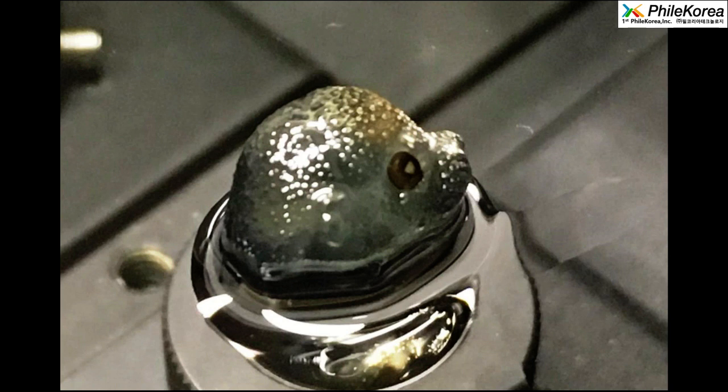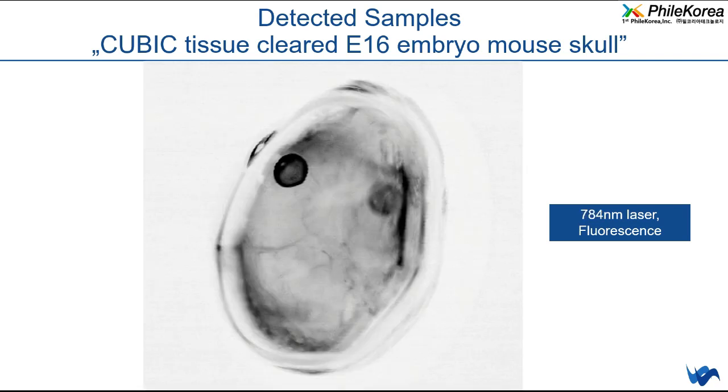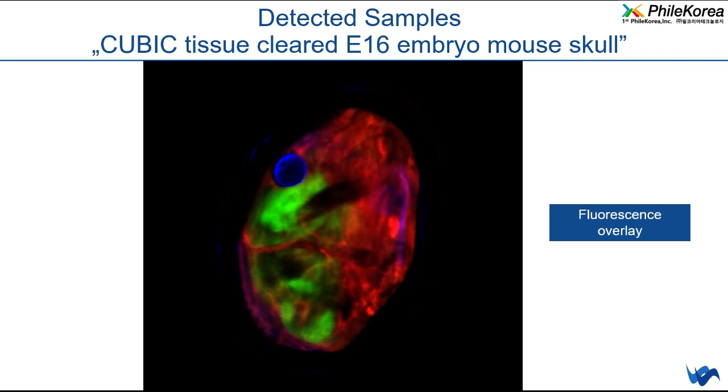In this case, interesting for us was the GFP fusion protein, so the signal which is here in the brain of the animal. Of course this is not lying on the glass surface, so we had to move the scanning head up in that position. I think in this case we used 4 millimeters, moving the scanning head up to get the image sharp, and I show you here the results. Let's go to the final merge. Here you can see it. Here's the GFP signal in the brain in green. Here we see also the eye of the animal.